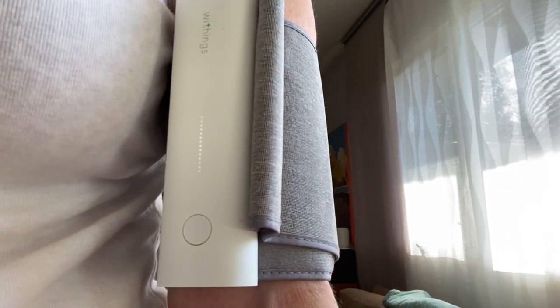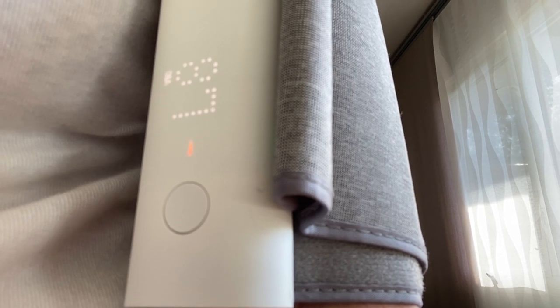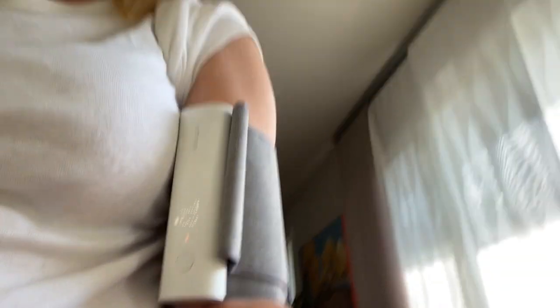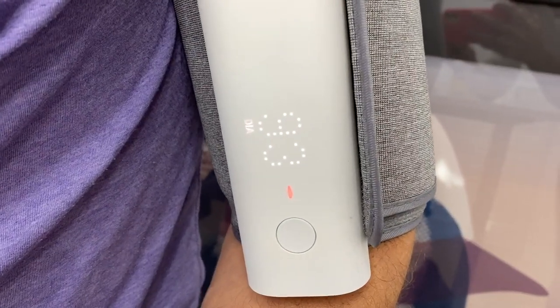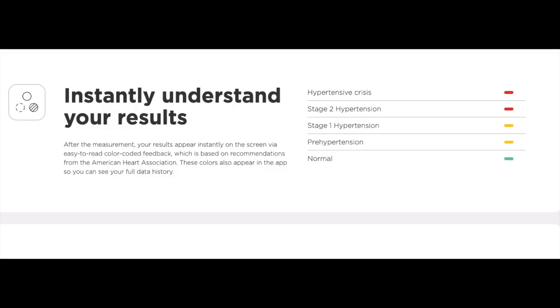It does squeeze your arm pretty good. It's just released now and I'm getting the reading — it's actually showing a kind of medium level concern, which is very funny because I'm completely not doing this in a relaxed manner. But you get your reading on the little readout, and that information is also going to pop into the app on your smartphone. The LED display will show you your numerical readings and also give you a color-coded light that tells you if your blood pressure is normal or up to hypertensive based on recommendations from the American Heart Association. These colors also appear in the app so you can see your full data history.